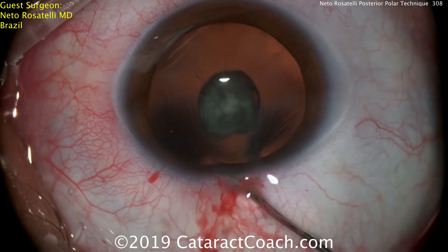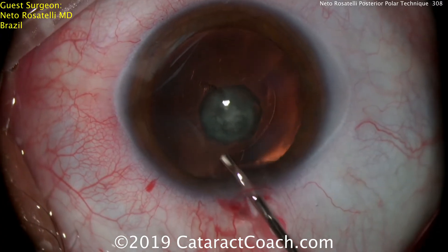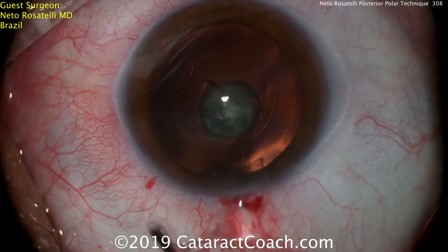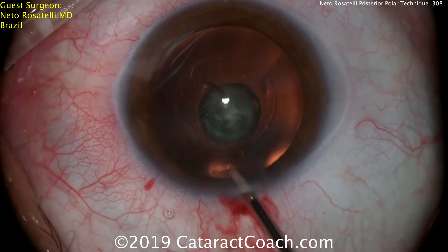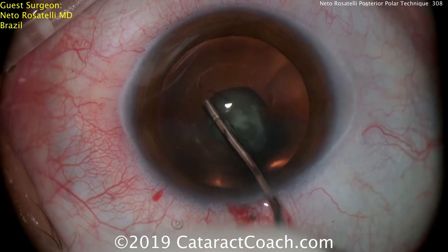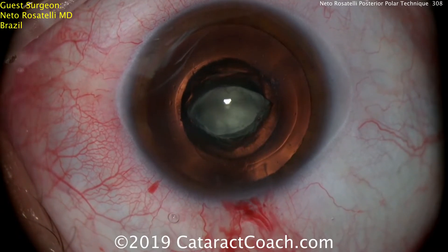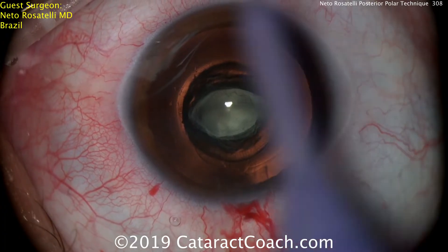Watch carefully — no hydrodissection, only delineation. He'll go towards the center of the nucleus, just the hydrodelineation wave. That's it. And you can see that the central piece of the endonucleus has come up.